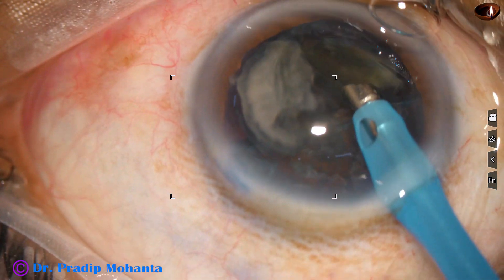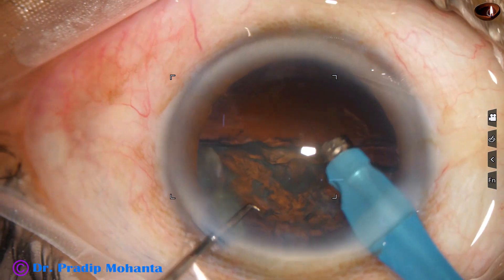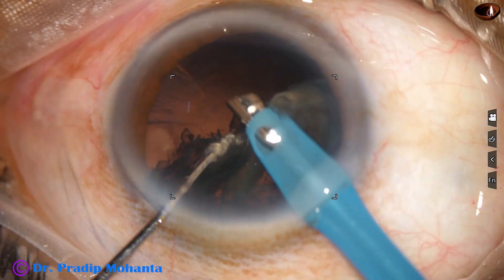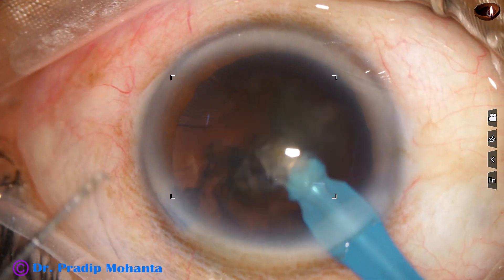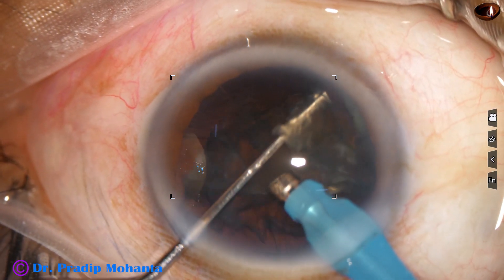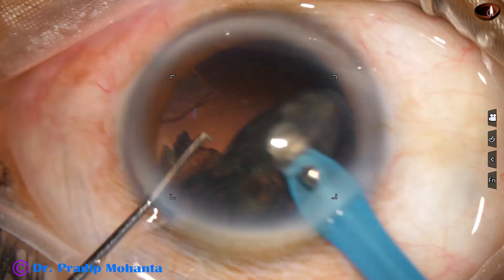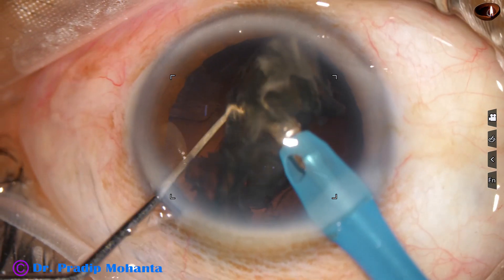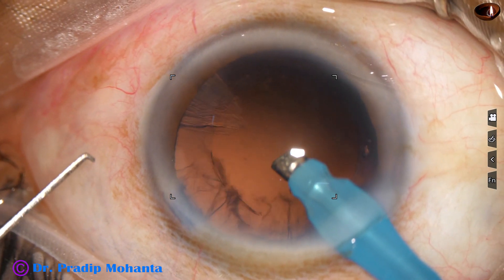The other fragment is emulsified. As I remove the chopper, followability of the piece increases. Now this is the management of the other hemi-nucleus — we are going to see this in slow motion. Whenever we have the problem of holding the hemi-nucleus and dividing it, we need to go to one end, tumble the piece out of the capsular bag, and start eating it up from some point, always keeping an eye on the posterior capsule.